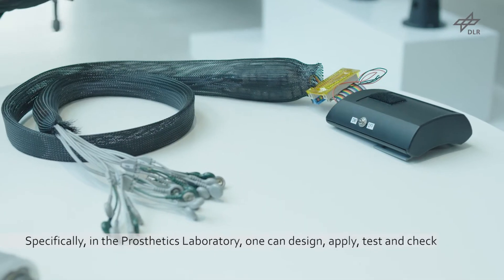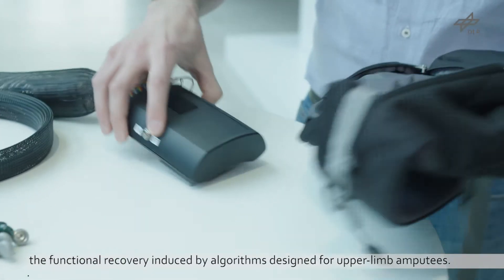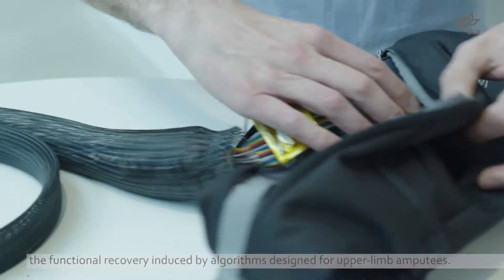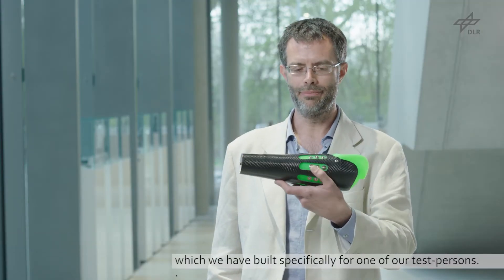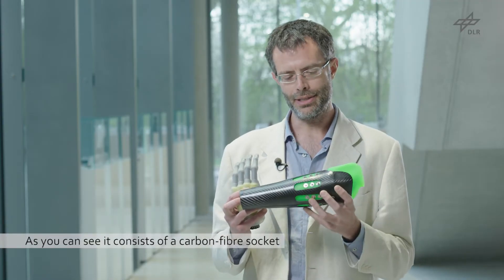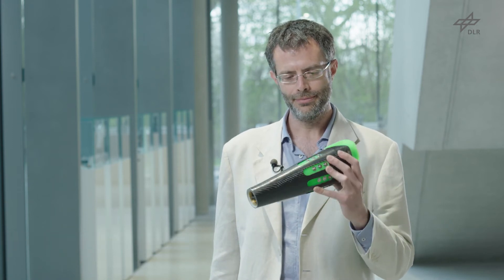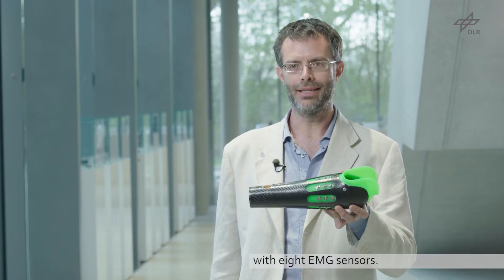Specifically, in the prosthetics laboratory one can design, apply, test and check the functional recovery of algorithms designed for upper limb amputees. As an example, we have here a socket which we have built specifically for one of our test persons. As you can see, it consists of a carbon fiber socket with eight EMG sensors.